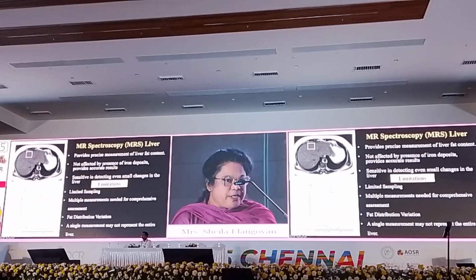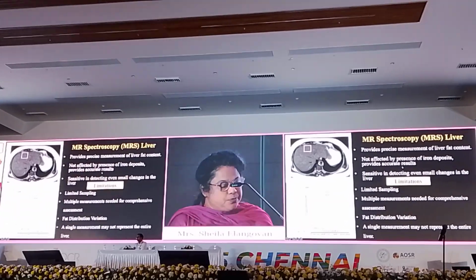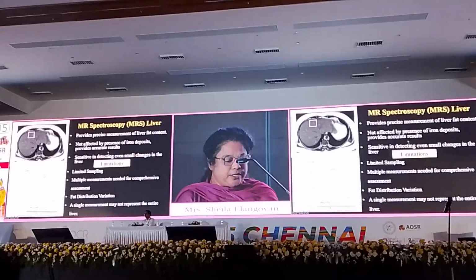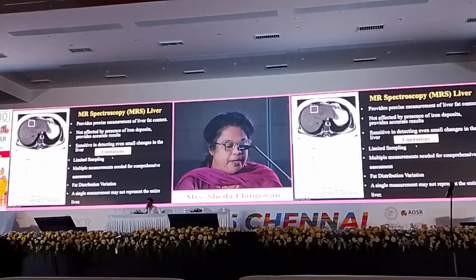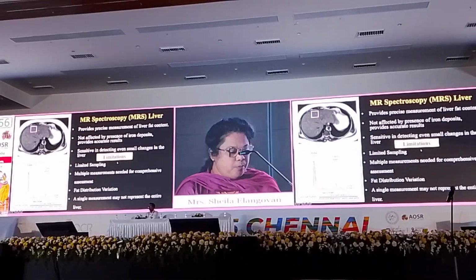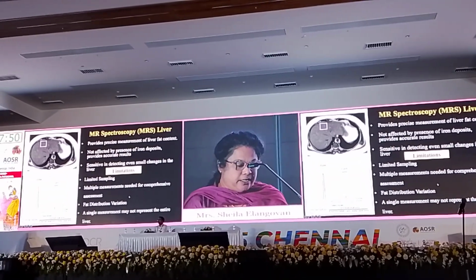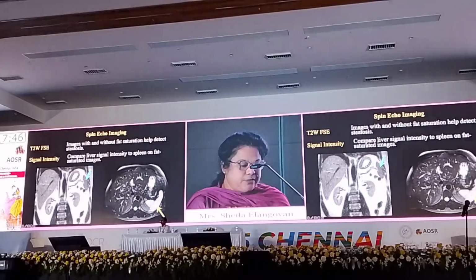Of course, MR spectroscopy can be used for quantifying fat. It provides very precise measurement. It isn't affected by iron deposits. It gives, in fact, accurate results, and it is also very sensitive to small changes. But then, the limitations are you can only sample a very small portion and multiple measurements are needed. Also, the fat distribution is varied and hence a single measurement might not be sufficient. So we need to go for a different technique.